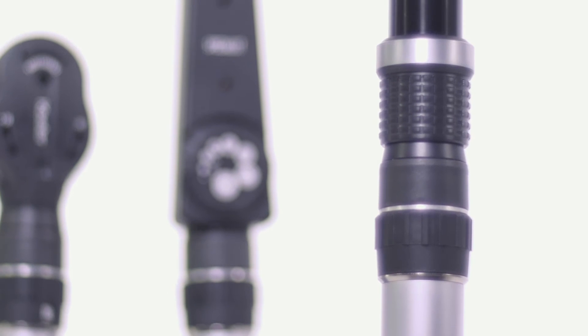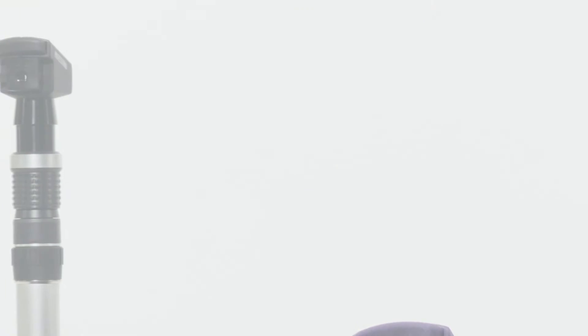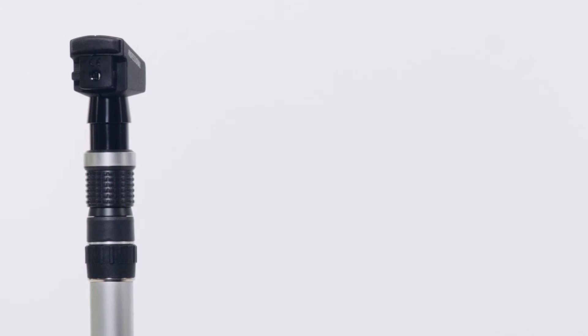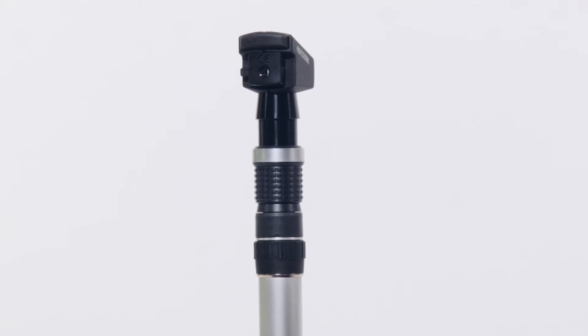The Keillor Professional Retinoscope is optimized for outstanding performance with either a streak or spot beam. It also features LED technology for streak or halogen illumination for both modes, guaranteeing enough light to refract even difficult eyes.